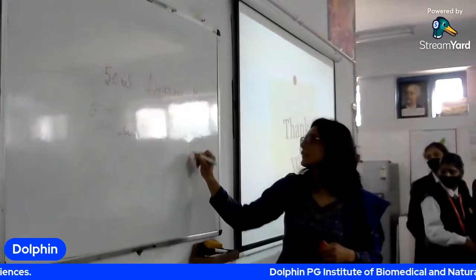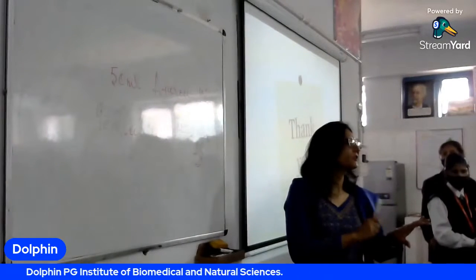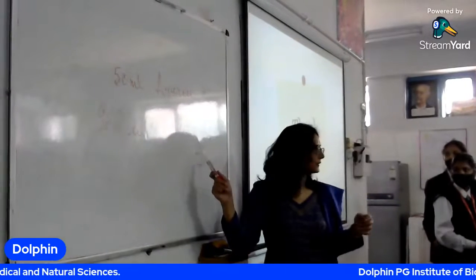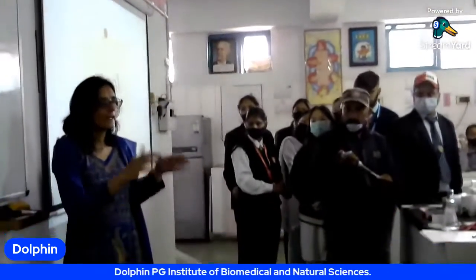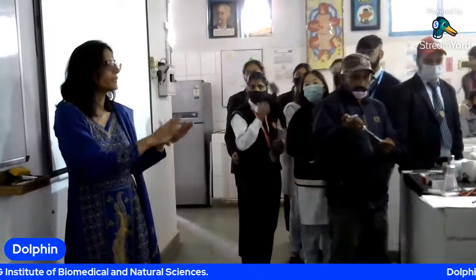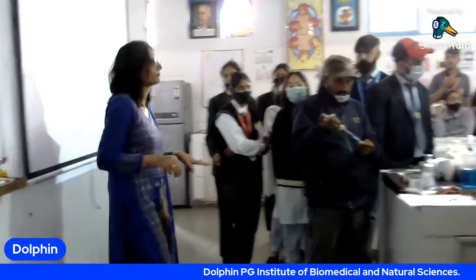Now the antiserum contains what? Antibody. So this temperature is tolerable. It is neither too cold, neither too hot. Once we add this antiserum, then we will mix it by rotating properly so that there is uniform distribution. And as soon as we add, you will make your gel. You will add it on your glass plate. And then we will incubate it in the moist chamber.